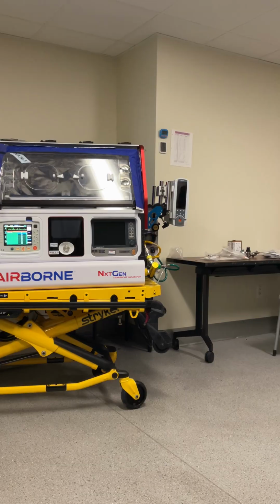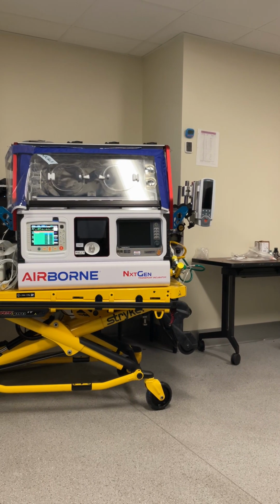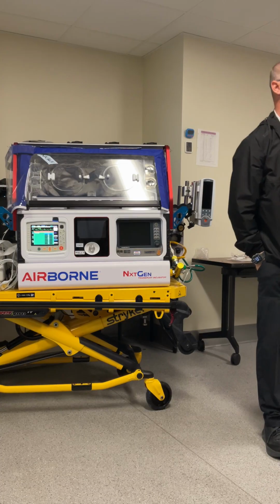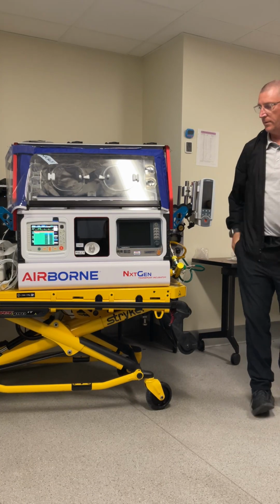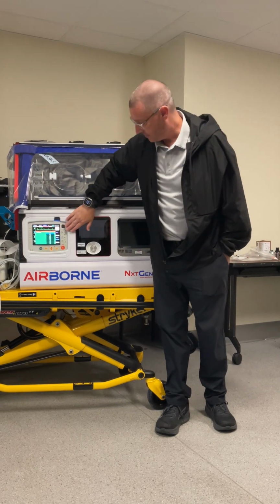To zero, if this was hooked up, underneath the P1, the second one that's open right now, would say 0. That one here says 0. So underneath P1, it would say 0. So you just hit that one when you're ready to zero it, in the little box. Yep. The quick access key. You good with that?